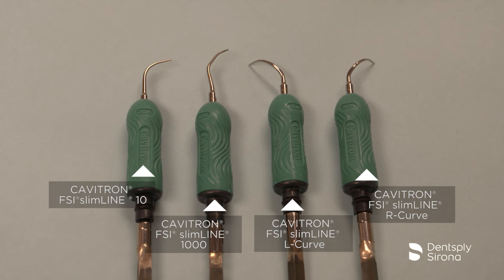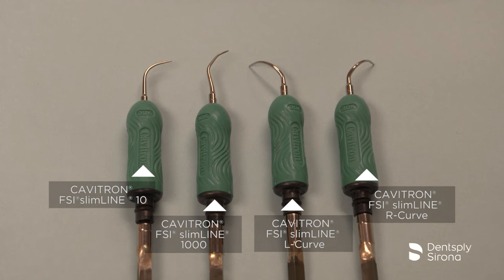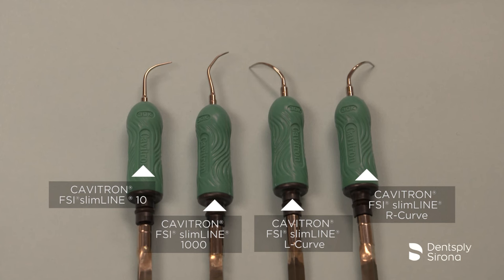Following an initial gross debridement, the clinician will follow through with a finer debridement to ensure removal of lighter calculus, remaining biofilm, and endotoxins. The Slimline series are designed for patients that present light to moderate calculus and tissue topography and/or pocket depth which call for a slimmer diameter insert for access.